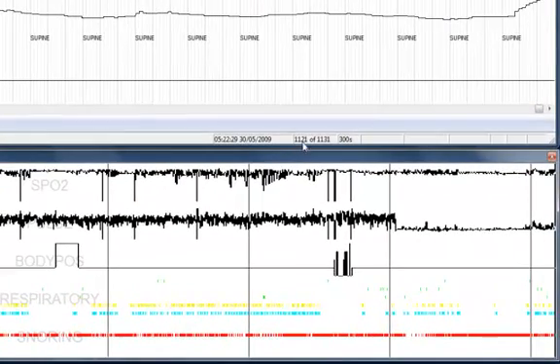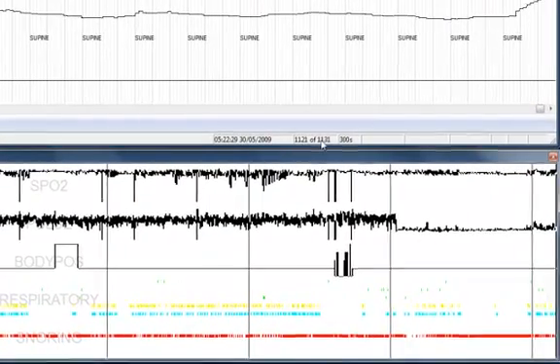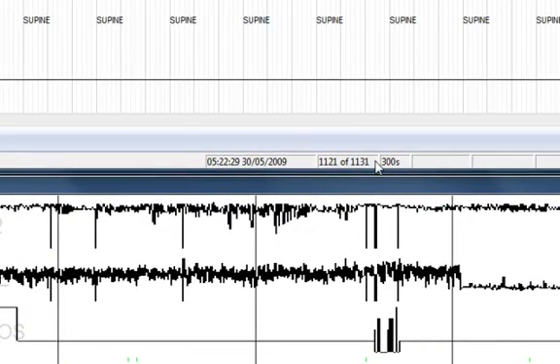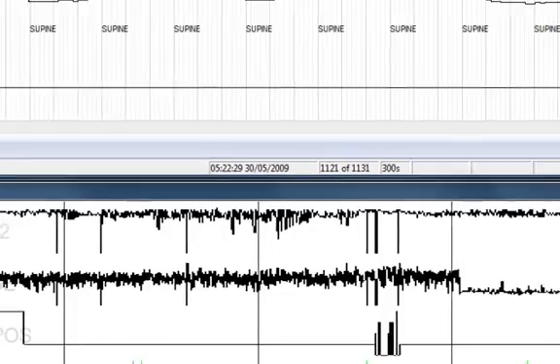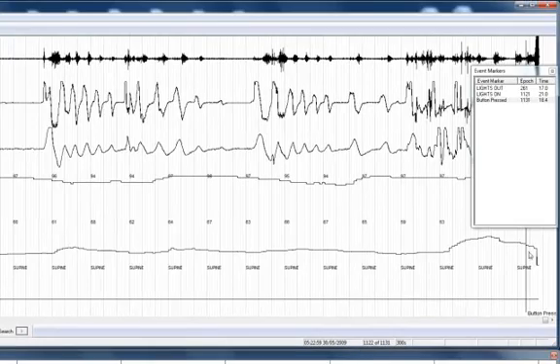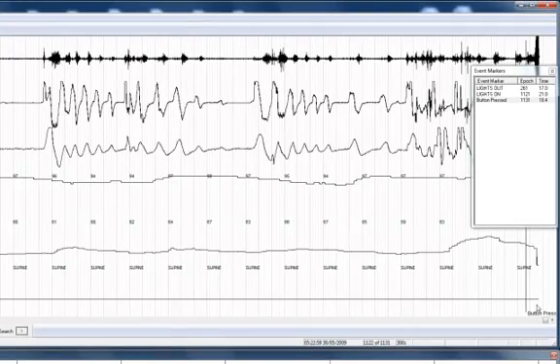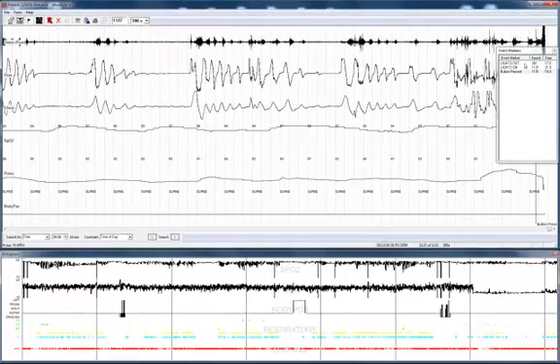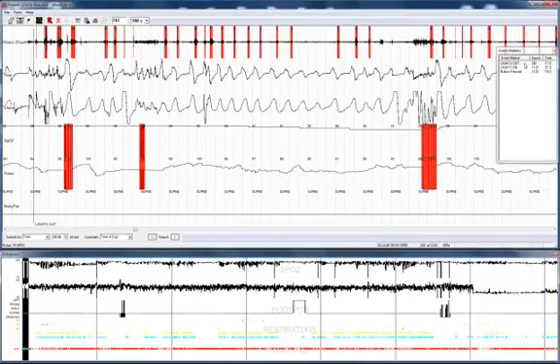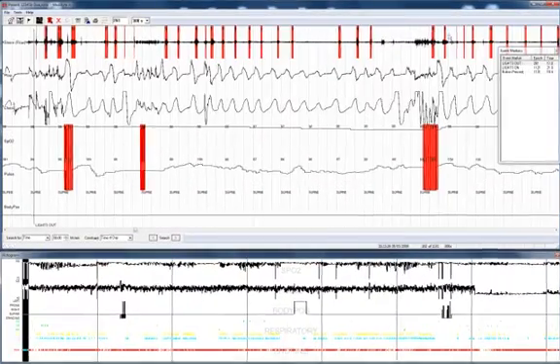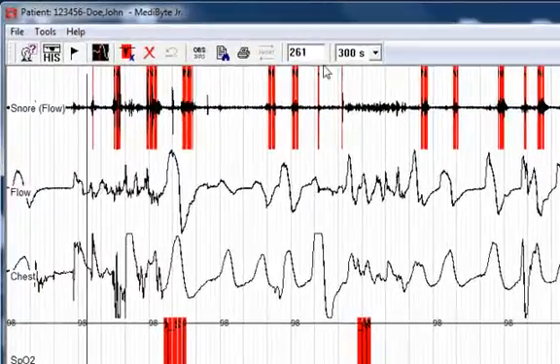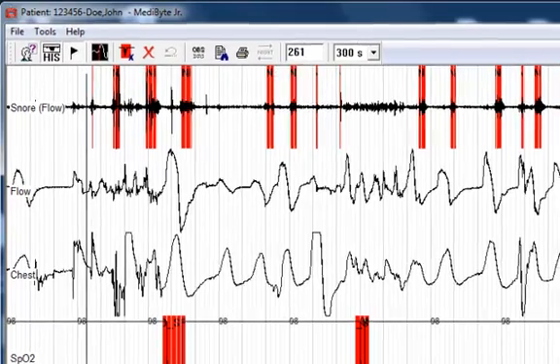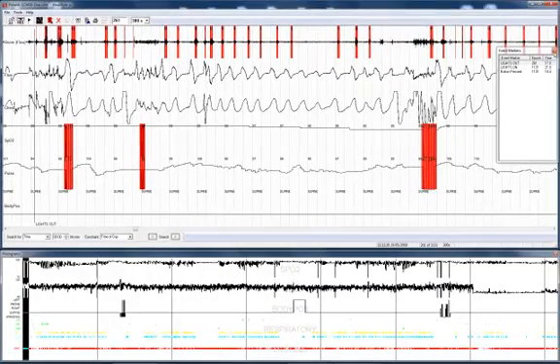It's also shown here as 1,121 of a total of 1,131 pages. Each page is 30 seconds in duration, which is called an epoch in the sleep nomenclature. This indicates the end of the recording when the patient woke up and actually pressed the button. At the beginning of the recording, I would double left click and again it jumps to page 261. You can close the event marker window by clicking on the X.